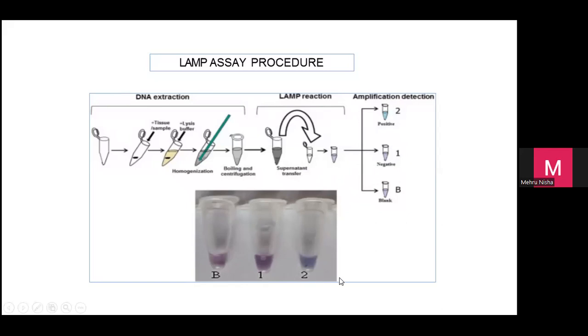So kit tu akan beritahulah, our stool kit atau lain-lain kit, dia akan beritahu kalau tukar warna apa, ialah positif. So just why yang ni digalakkan sekarang sebab kita boleh buat at the spot dan tidak perlukan mesin yang mahal. So this is actually one of the procedure, tapi frankly dalam bidang parasite kurang diguna. Hopefully in future we will investigate this more lah.